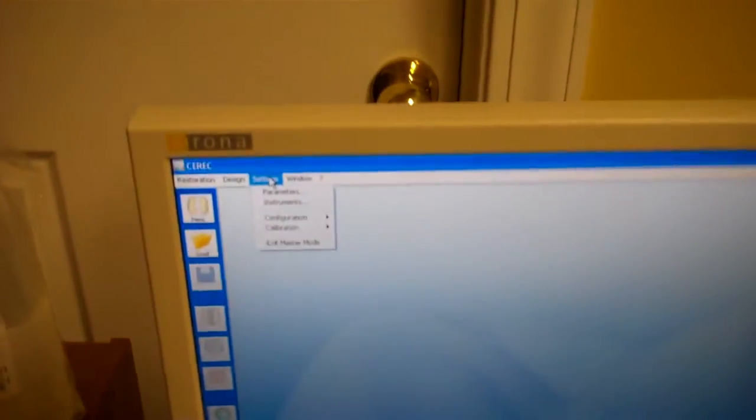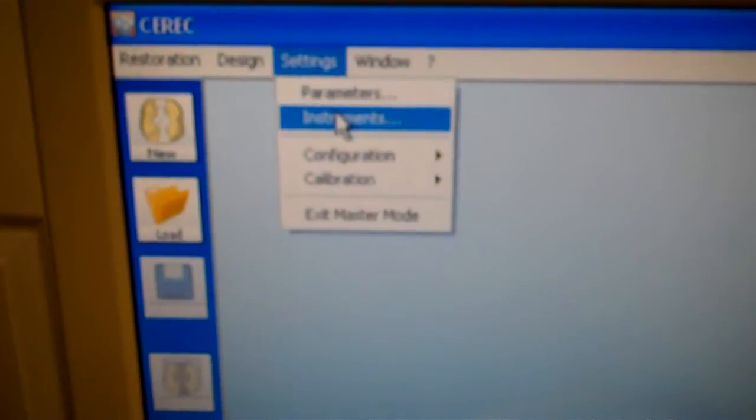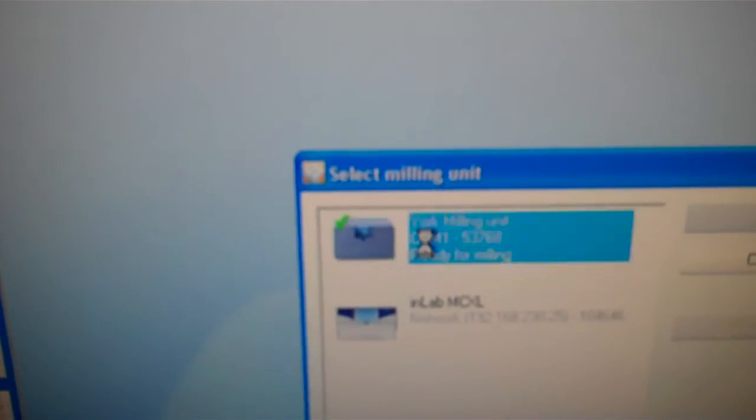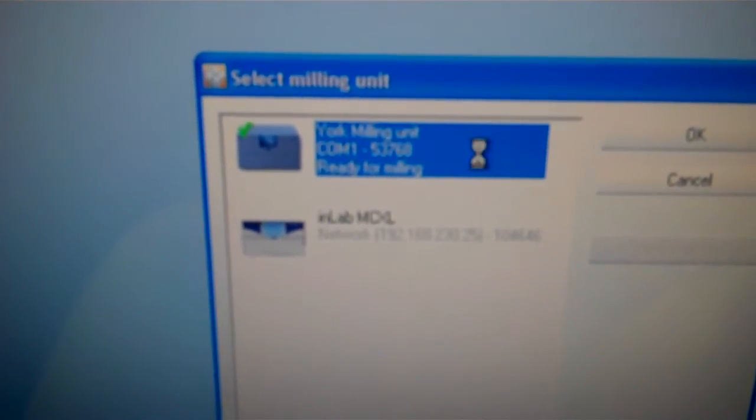Okay Doug, to change the burrs when they have too much wear, all you do is go to Settings, then go to Instruments, select the right milling unit. You're only going to have this one.